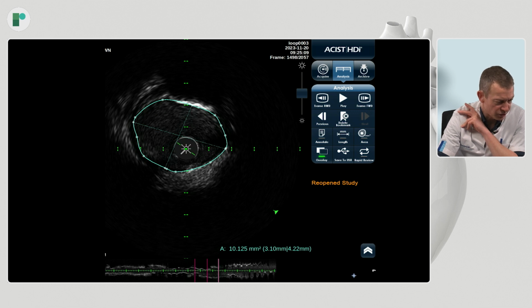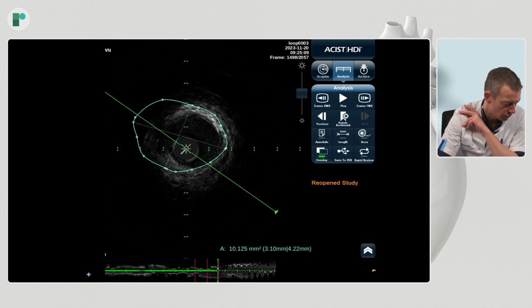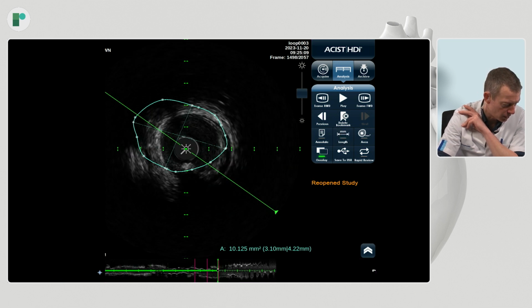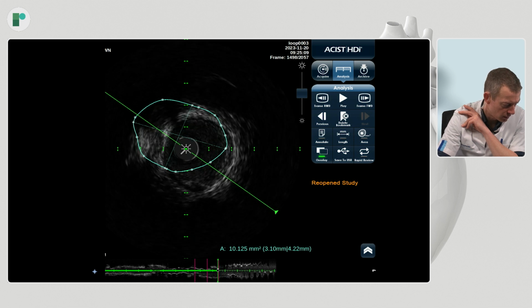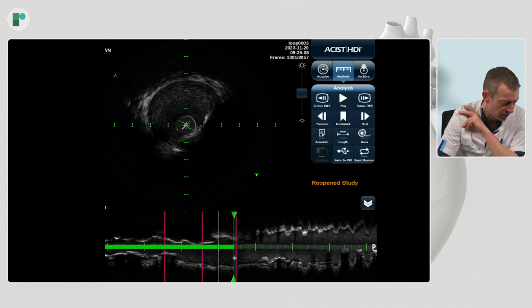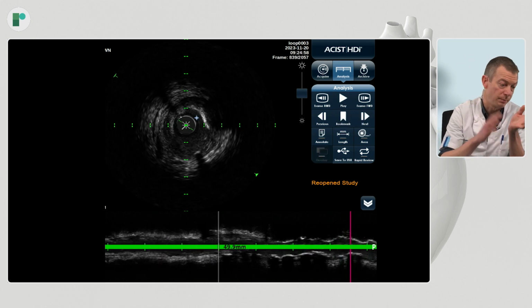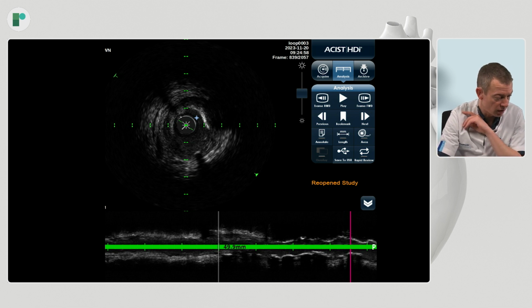Then it's time to measure your stent length. So you can take the length tool and go from bookmark to bookmark. Make it a bit bigger. And then we have a length of almost 50 millimeters. So we don't have stents of 50, so you could either pick 2 stents or give up 1 millimeter distal and take your 48 stent that we have here on the shelf.